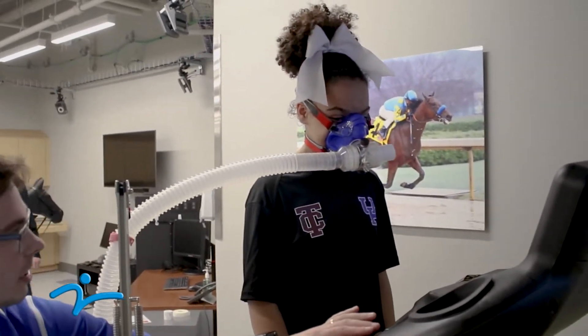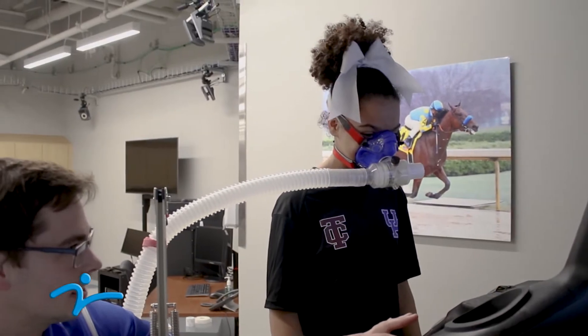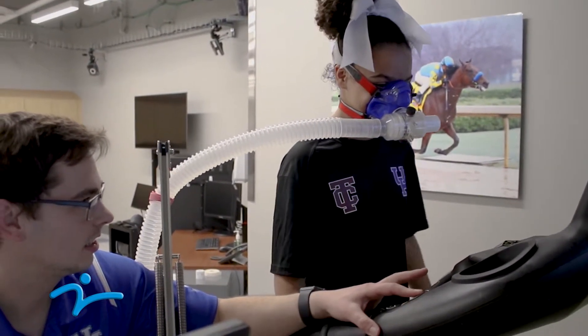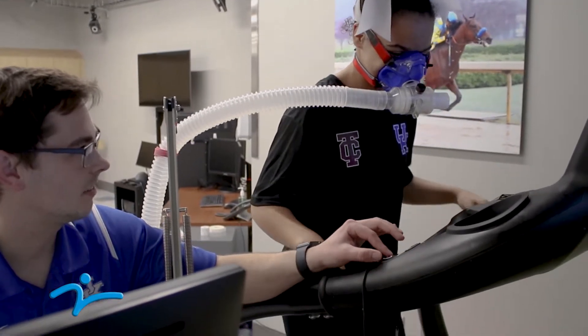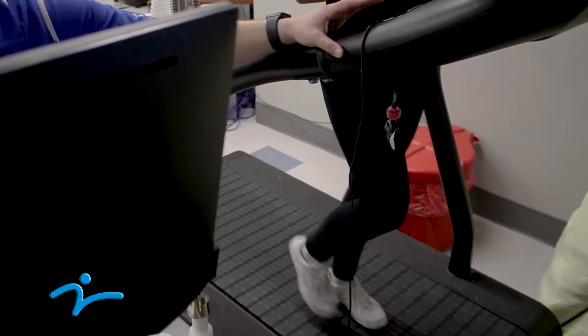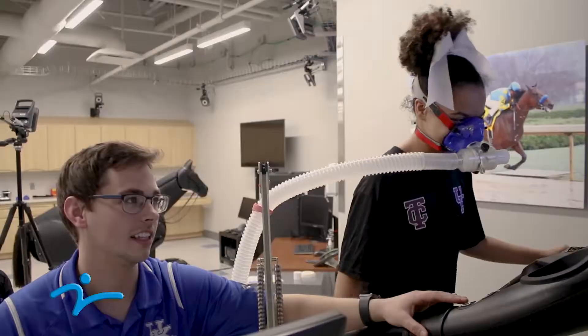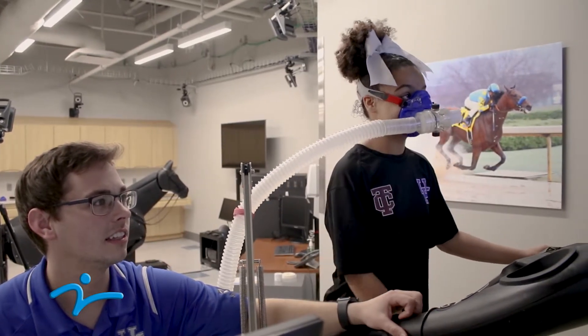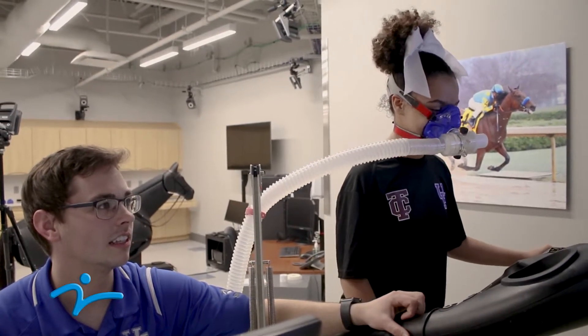I'm gonna increase this just so you're walking at a comfortable pace. As you're running you're wearing this mask and this tube, and we actually know how much oxygen is in the air, and then how much carbon dioxide you're breathing out. This machine is actually able to work out the difference between the oxygen in the air and how much carbon dioxide you're breathing out.